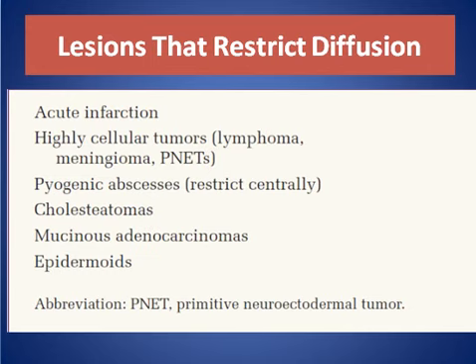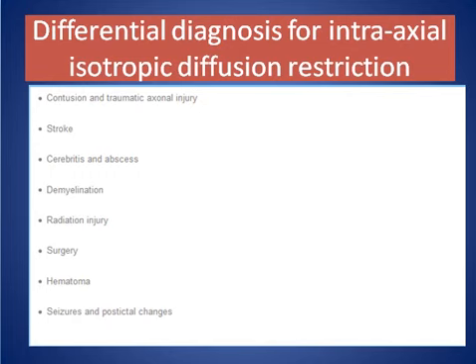Also, we can use it in encephalitis, encephalomyelitis, meningioma, and multiple sclerosis, and in patients with epilepsy. And also to evaluate the patient with contusion and traumatic axonal injury.